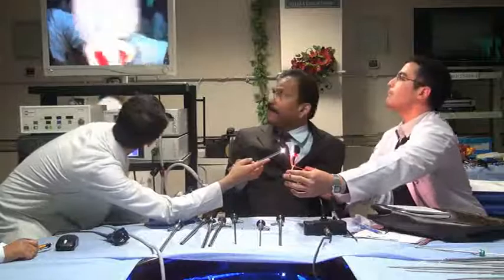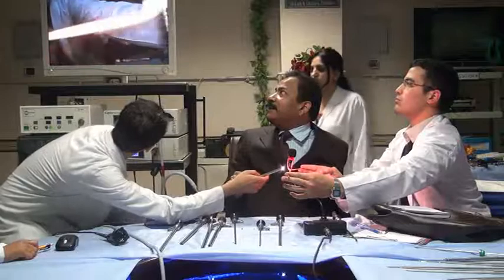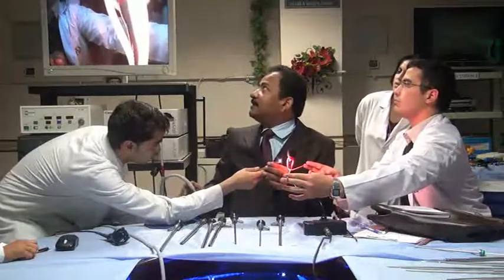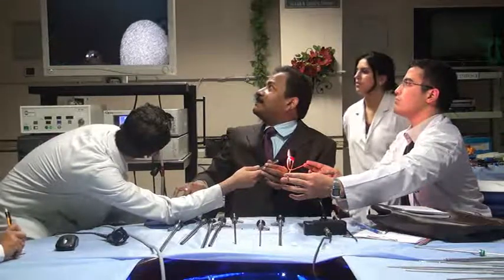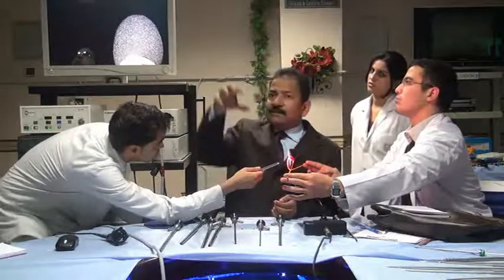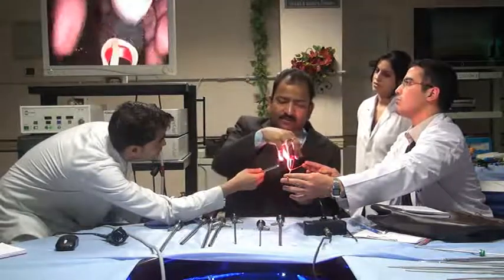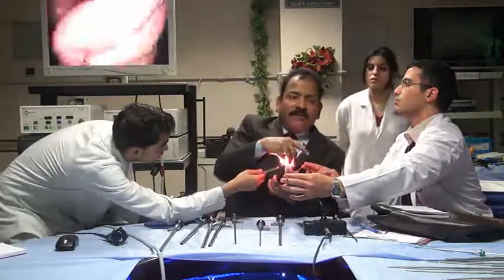See on the screen. This is the fundus. This is the cystic duct, cystic artery, isn't it? And here is the CBD going. Right? Now suddenly the camera person, at 0 degrees, has rotated like this. See what happened? By rotating this, the gallbladder is sinking, and now you are seeing only the fundus. Now the person doing the surgery will push the fundus up.